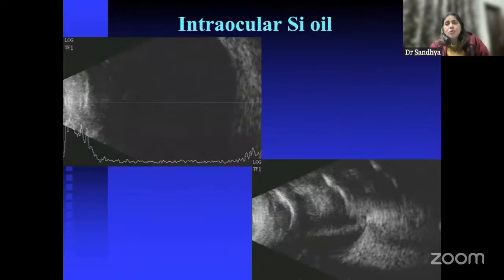Many a times we do vitreoretinal surgery for RDs and all those things. We put oil, and the patients keep coming to us for follow-up. A couple of months later, we don't know, the oil is there inside, but so many times we suspect that there is something wrong, and probably there's some subretinal fluid, there's some RD, but we're not sure. We want to know whether the retina is really attached or not. There's a shallow detachment, there's a shallow subretinal fluid. So we take the patient for ultrasound, but it's not so easy. We don't get a very good picture on ultrasound in silicone filled eyes.